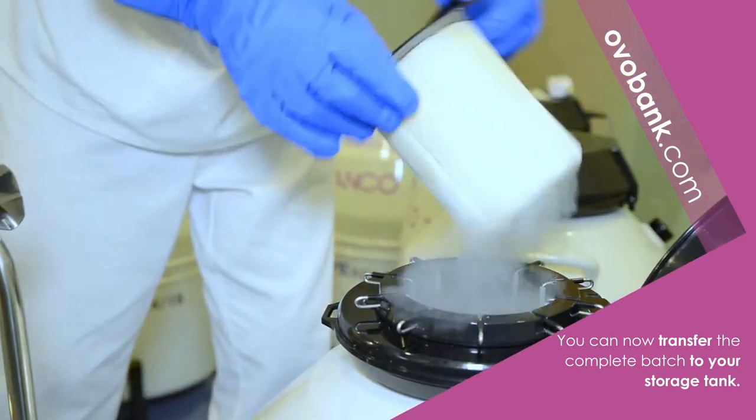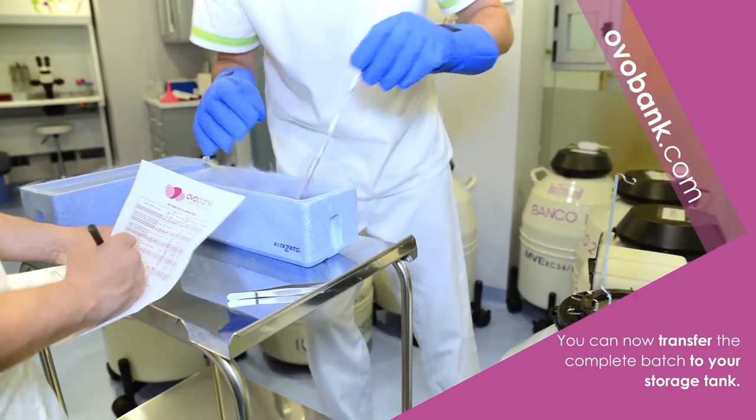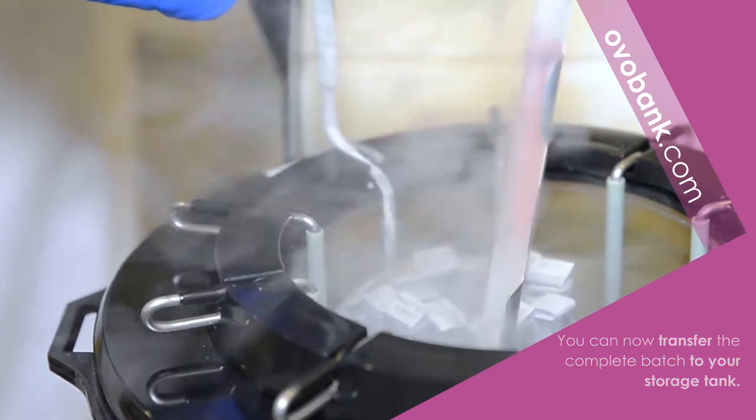Transfer the rod along with the goblet containing the cryotops to your storage tank, and empty any remaining liquid nitrogen into the shipping container.